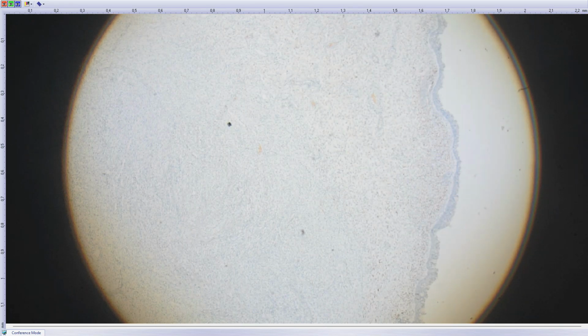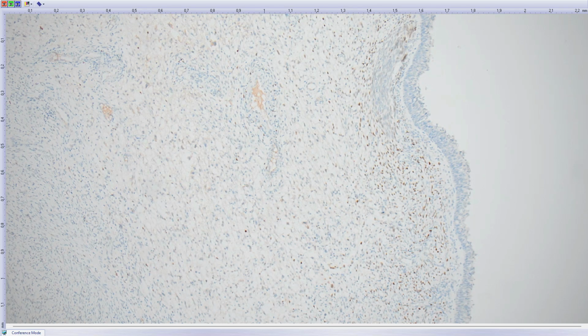Okay, that's positivity, and it will show also staining for some muscle markers, including rhabdo markers. So in this case, I believe it was MyoD1 focally positive. The expression is not very diffuse, but yeah, it's there. Okay, so some cells are positive.